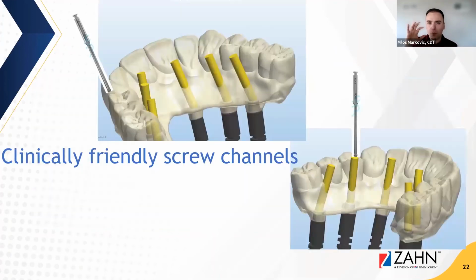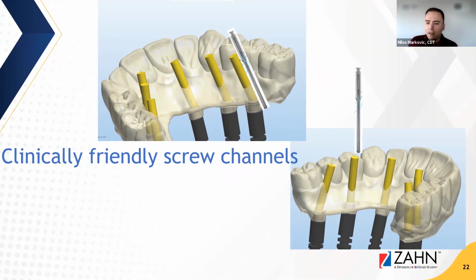So, to put it in a simple animation, you want to make sure you move them under that 25-degree angle. This is their angled screwdriver. It's the same for all the platforms. So you just need to buy one, or buy one for your dentist, and you can do all angled cases with the same driver. They come in two or three different sizes. I'm not quite sure, but I know there's a 25 millimeter and a 35. And then here, as you can see, the screwdriver trying to get in, it's really hard to screw in a big restoration at a 90-degree angle, especially when the patient has limited ability to open their mouth.